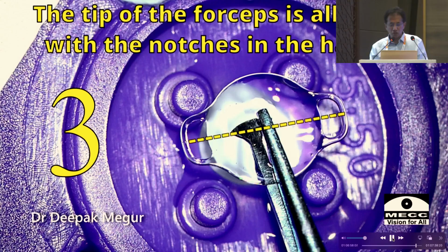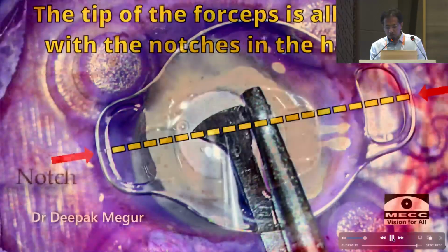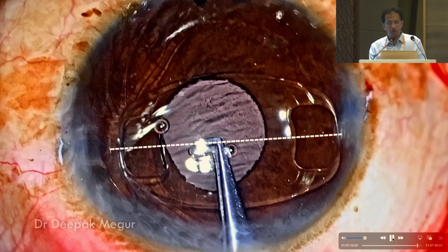And align the forceps in such a way that the tip is matching the notches in the haptic. Then use a blunt instrument to go ahead and tuck it. That should be it. And it gives us reasonably good results with very few complications and a very quick procedure.